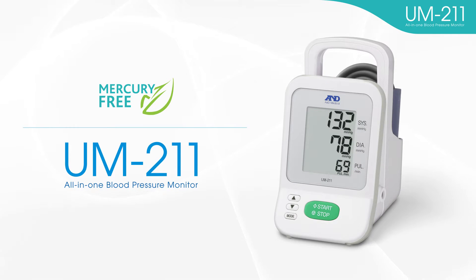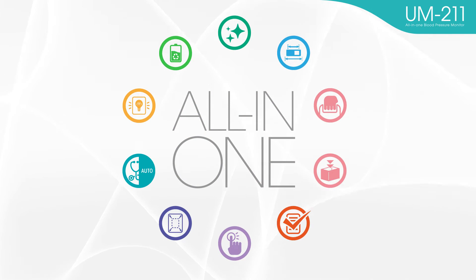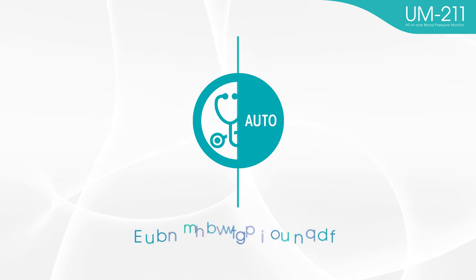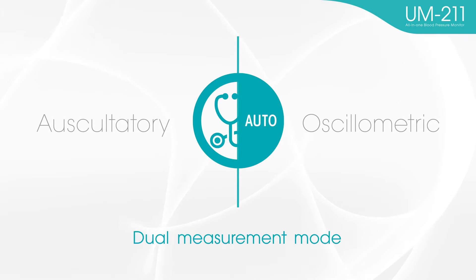The UM-211 is an all-in-one blood pressure monitor. This device contains all features necessary for medical settings. Dual measurement mode is available for the UM-211 — you can choose the auscultatory mode or oscillometric mode for measurement.